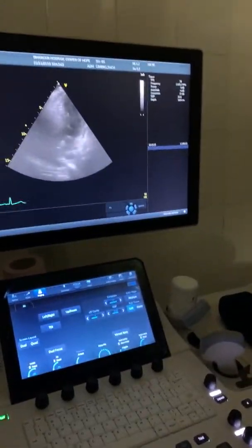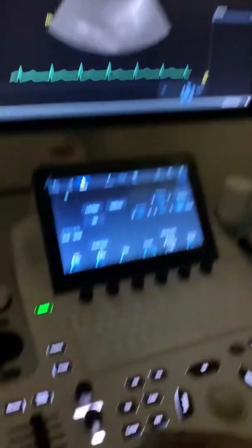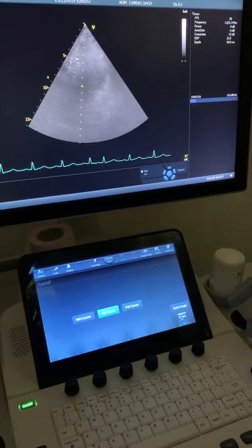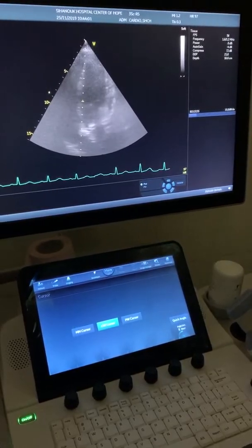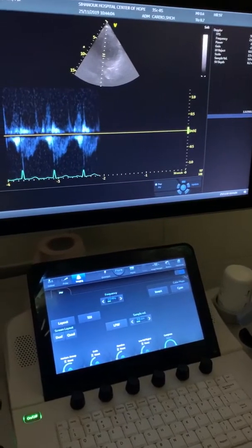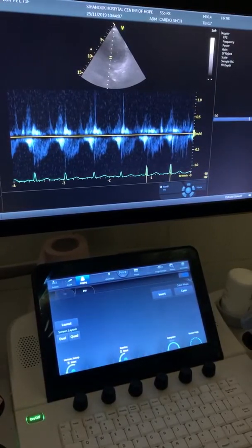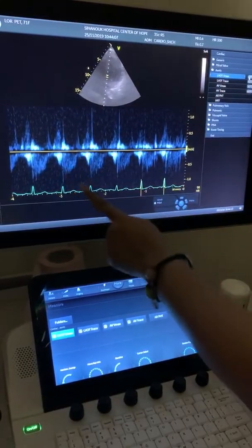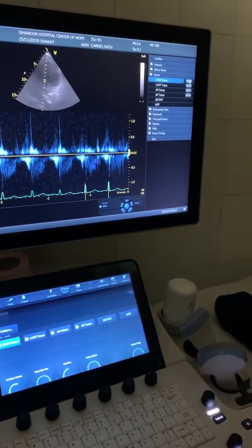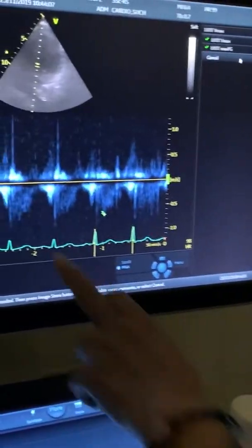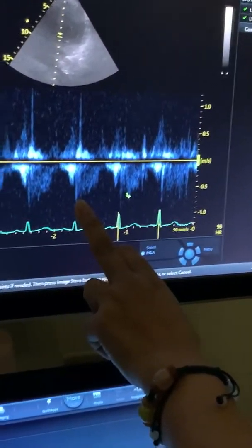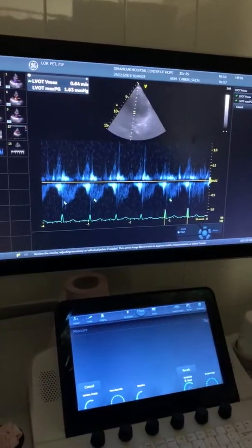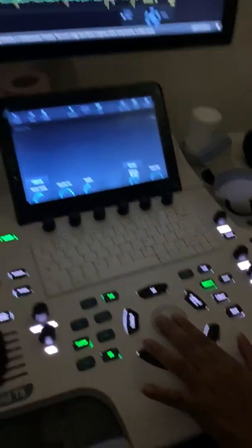Let me store this one. Now put the cursor on the aortic valve - before the aortic valve. Put PW, freeze, press measure - you see the aortic valve, right? Trace it - you're drawing the velocity. Press auto. Now this one - he's not sure because he might pick the wrong wave.